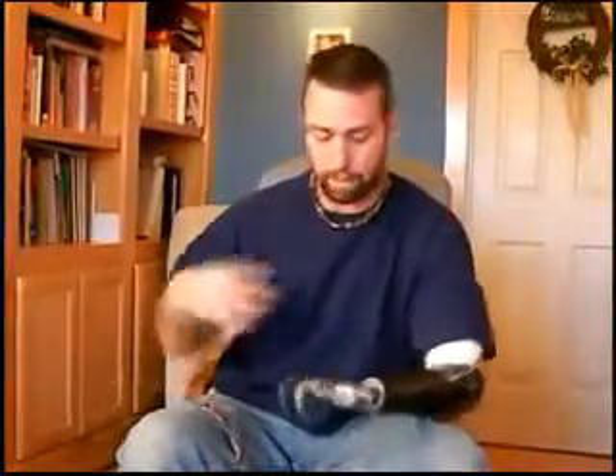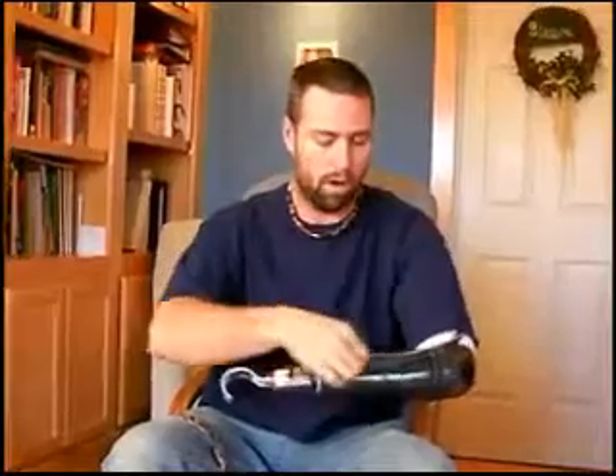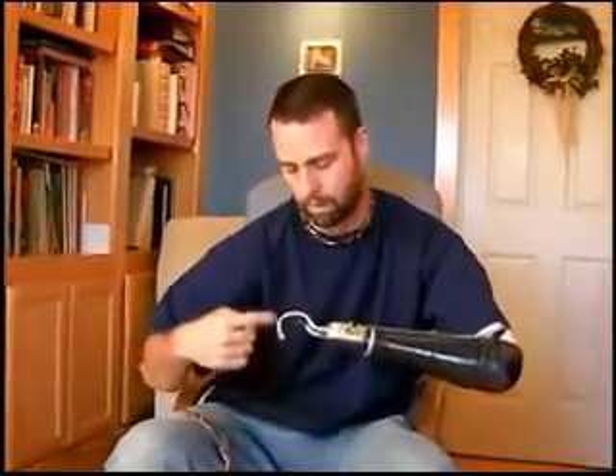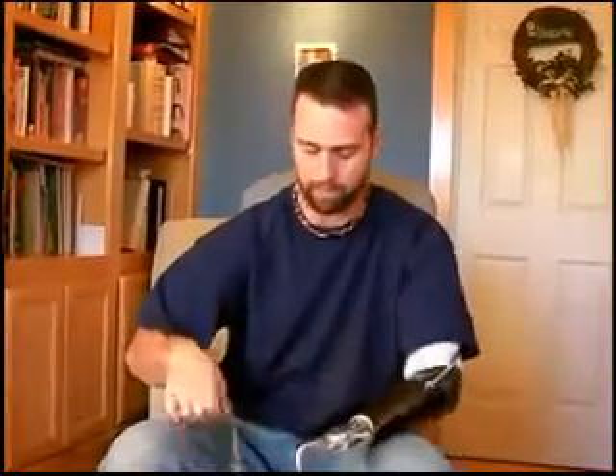Having it lock in place is almost essential. The most essential thing is when doing something close into your body, because there's not enough length in my arm and shortness of this cable to work in really well — closing the hook is much more difficult in close. Like if I'm doing something like tying a tie and I need to hold the tail of the tie — which I do every day — in carpentry you need this.